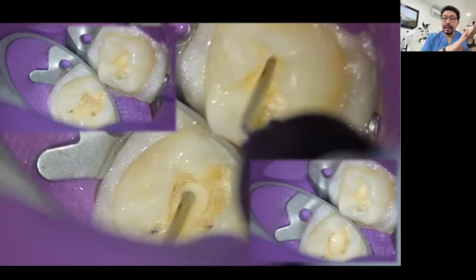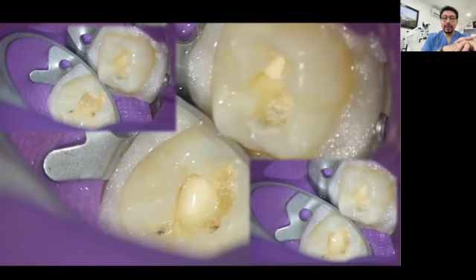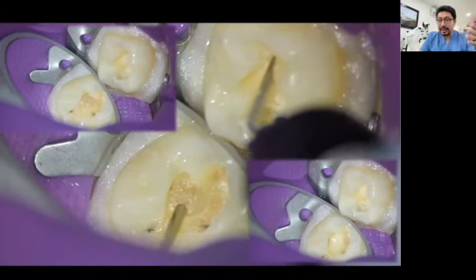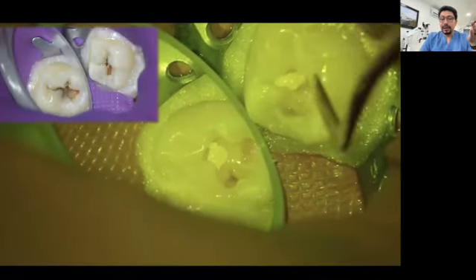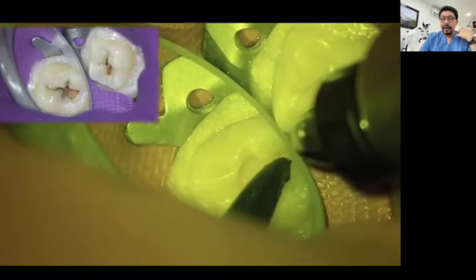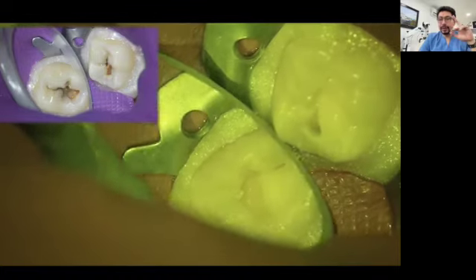And we can decide, okay, do I need to place a base? I am going to use a glass ionomer, maybe a bioactive material, and then we can proceed with our coronal restoration, with the adhesive restoration. The microscopes, most of them, they come with two filters.